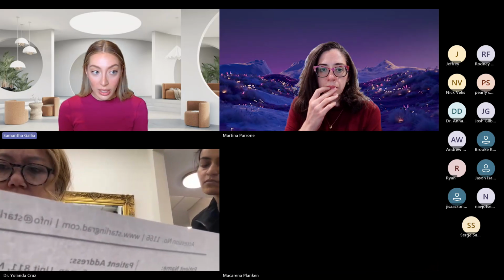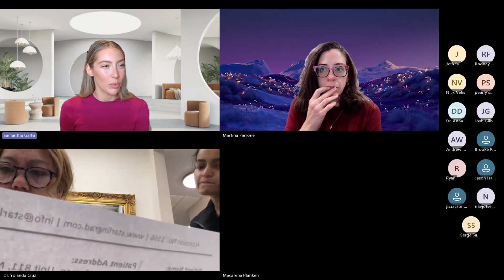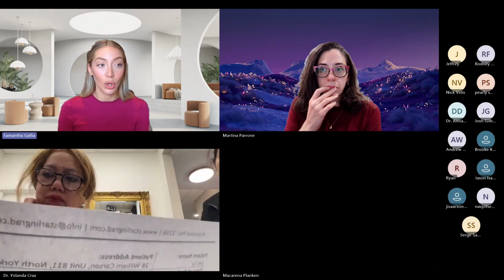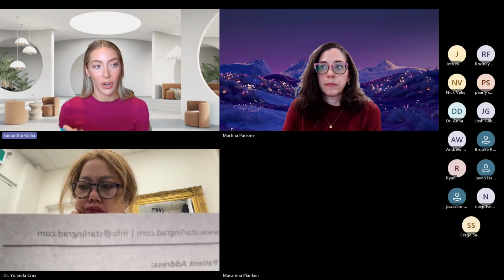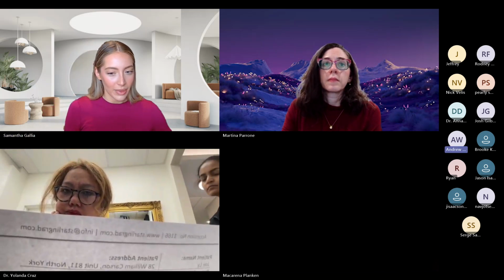But if you don't see bone, there might be bone present, but it would be super, super thin. So it almost wouldn't even affect it. If you're looking at an implant that is placed where it doesn't look like there's bone on the buccal surface, there could be very, very thin buccal bone. Does that help at all? Yes, that is perfect. Thank you very much.